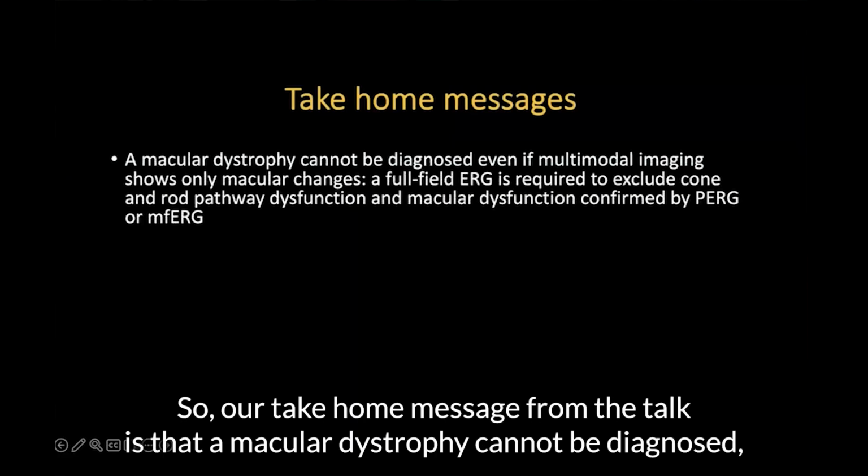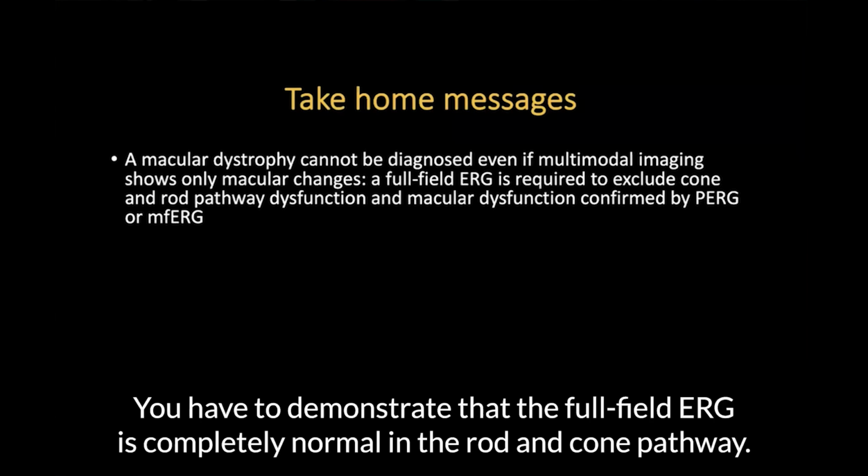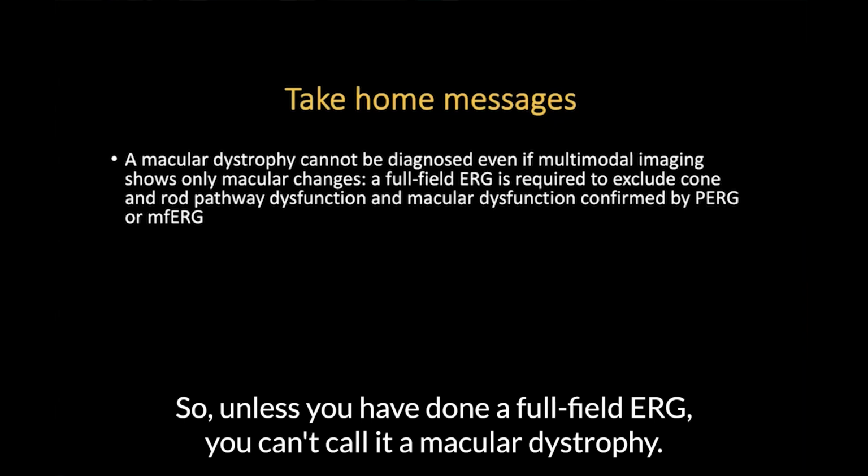So the take-home message from the talk is that a macular dystrophy cannot be diagnosed just based on imaging alone. You have to demonstrate that the full field ERG is completely normal in the rod and cone pathway. So unless you have done a full field ERG, you can't call it a macular dystrophy.